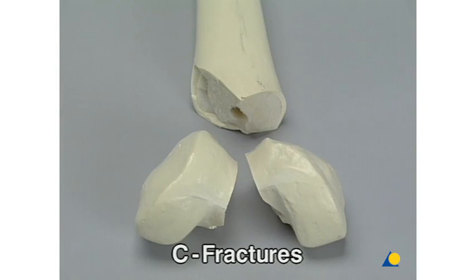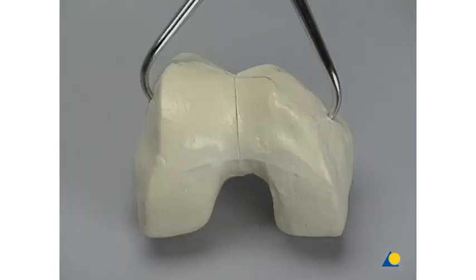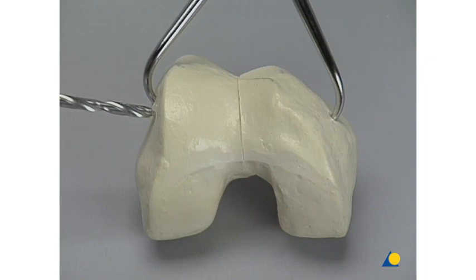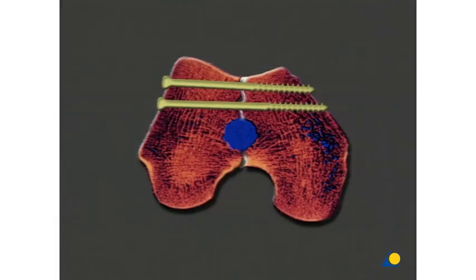The procedure for C fractures. In cases of intra-articular fractures, the condular mass requires treatment first. After reduction of the fracture, the position is held with reduction forceps, and before insertion of the nail, is definitely fixed with two cancellous lag screws. These screws should be positioned as far ventrally as possible, so as not to interfere with the nail, which is, as a rule, placed dorsally.